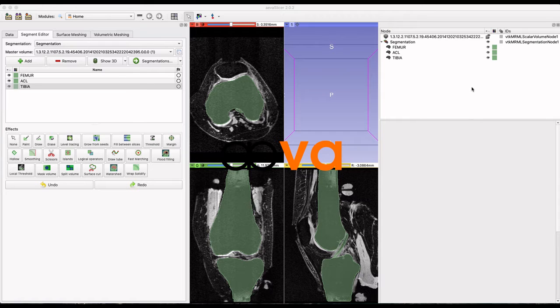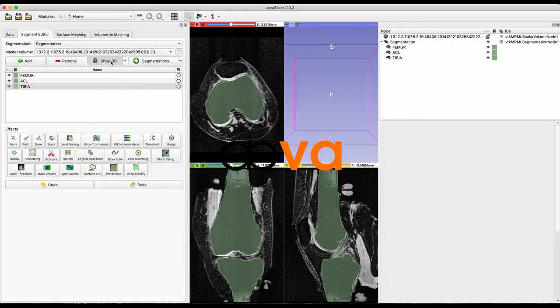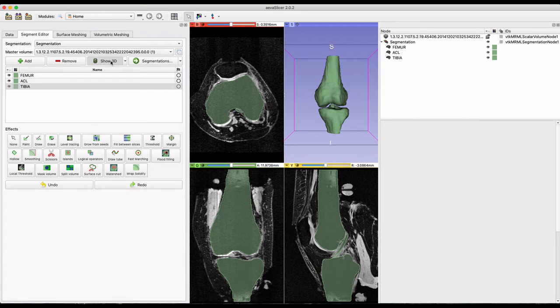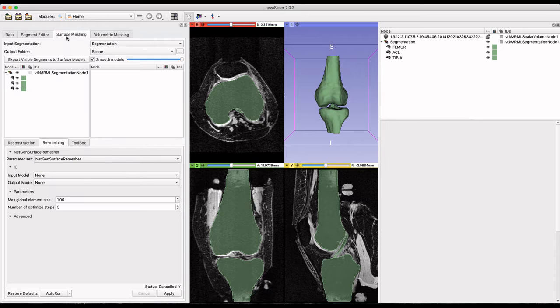This video will demonstrate how to generate triangulated surface meshes from segmentations using the surface meshing tool in AVA Slicer. Here I have imported femur, tibia, and ACL segmentations.